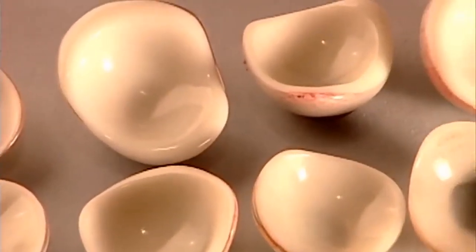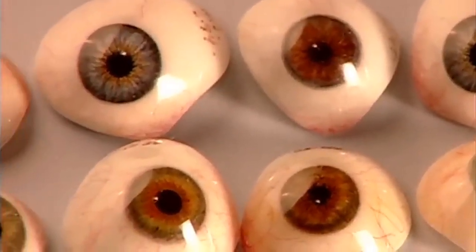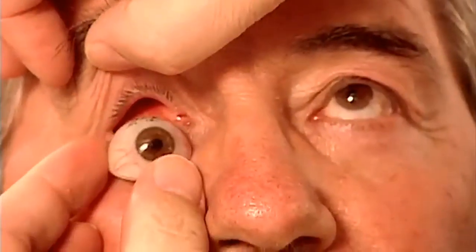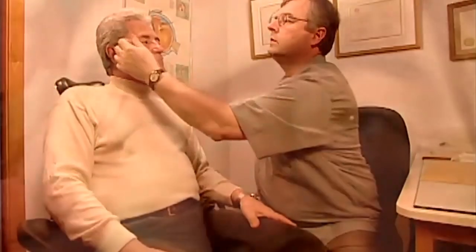The shapes and colors of artificial eyes are endless because patients' eye sockets and irises greatly vary, as do their scleras — the white of the eye. This artificial eye, or ocular prosthesis, is ready. The final step is to ensure that the fit is perfect. The patient's ocular muscles attach to the implant, enabling his artificial eye to move in unison with his real eye.